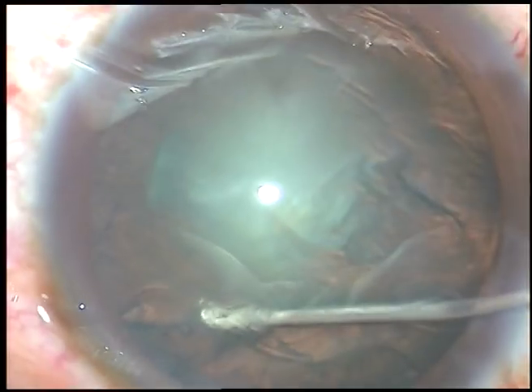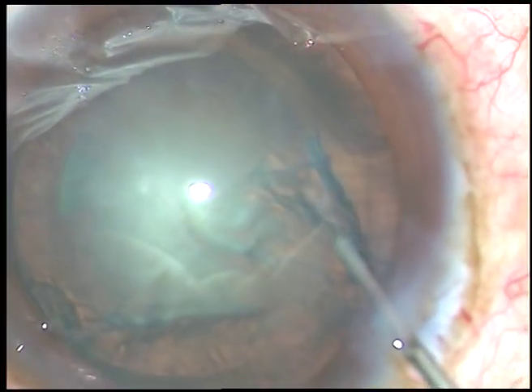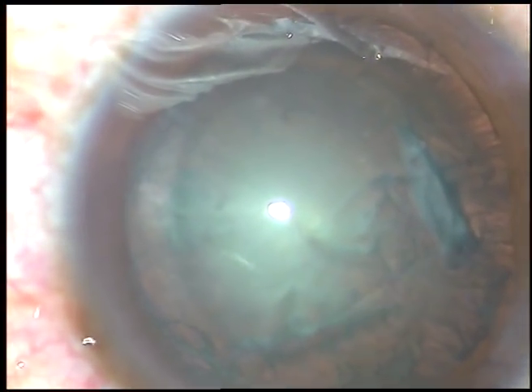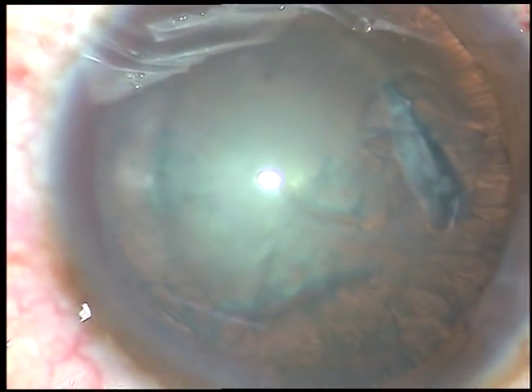This is hydrodissection and this is hydrodelineation. The cataract is soft — the grade of nuclear sclerosis will be about grade 2 or grade 2 plus.